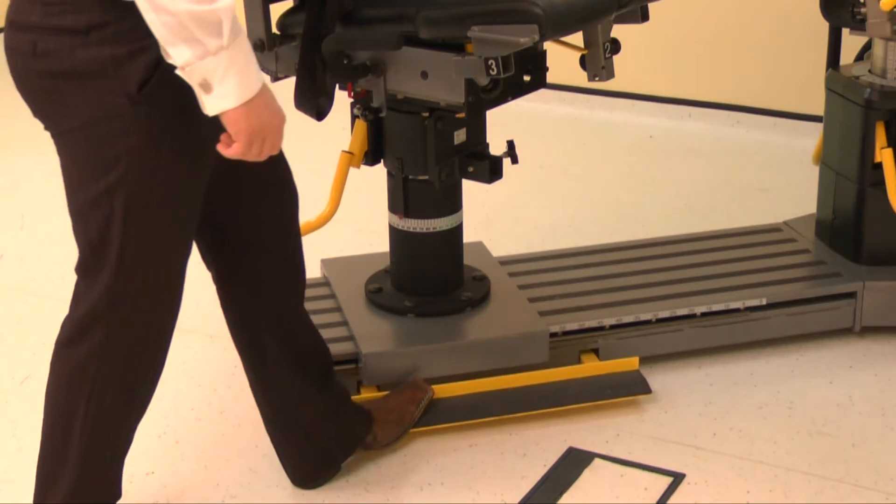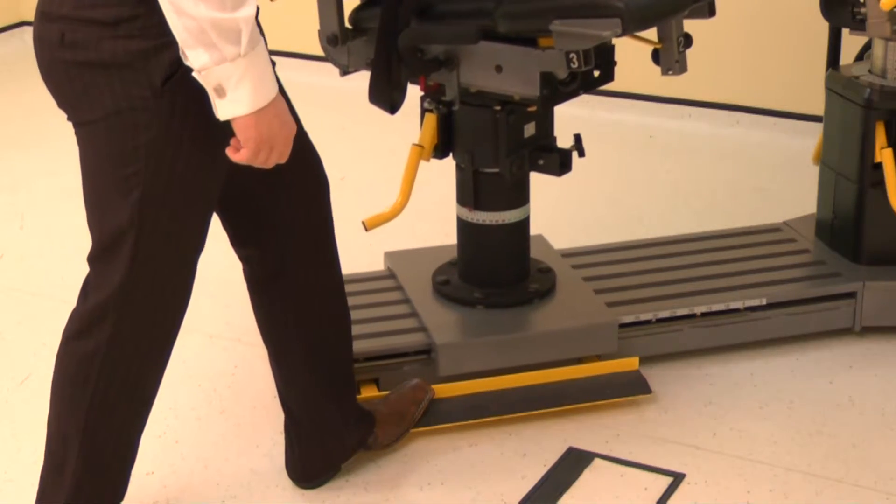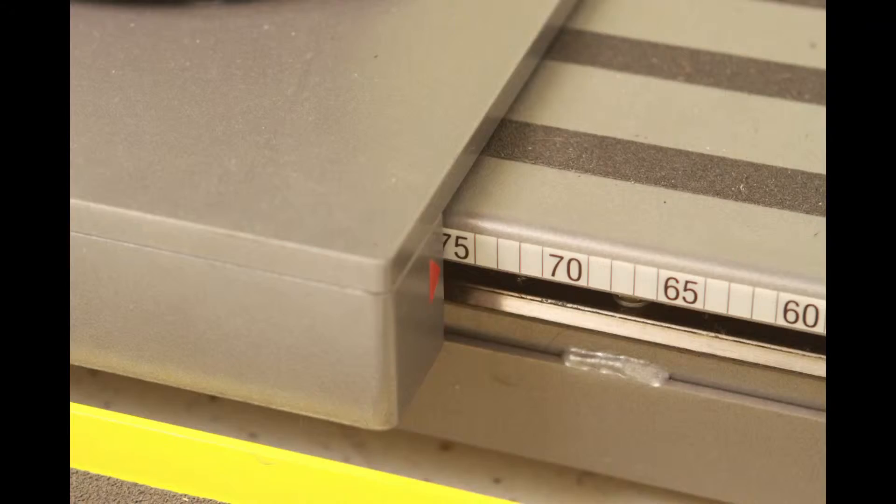Finally position the monorail by pressing the kickboard and sliding the chair to position 75.